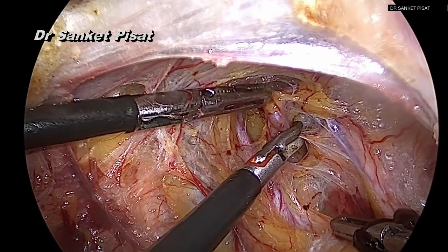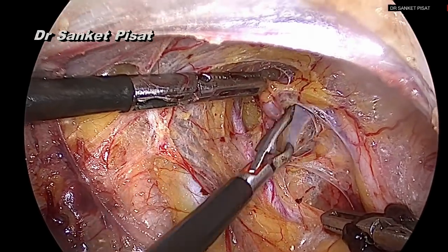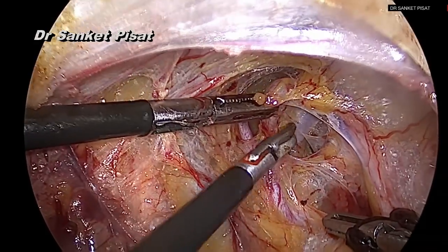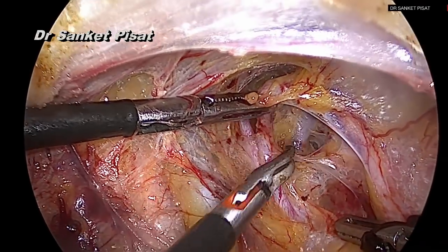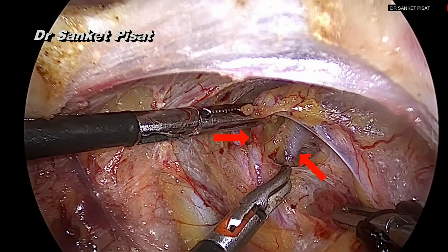The uterine artery is held and the fascia under the uterine artery is being dissected away in an effort to separate the uterine artery from the uterine vein. Once this separation is done, we can see that the uterine artery is in the surgeon's left hand on the top grasper, and the uterine vein is seen below, pointed by the lower red arrow, and between these two structures we can see the ureter safely entering into the ureteric tunnel. So the uterine artery is on top, the vein below, and the ureter entering in the fork between the two.